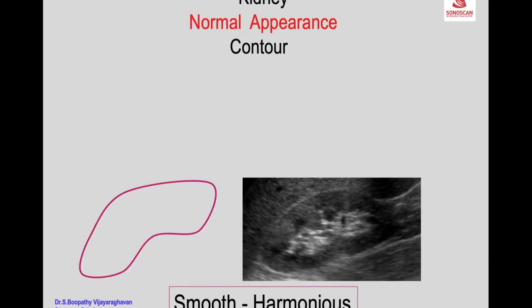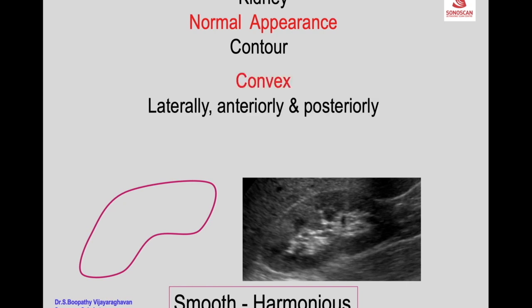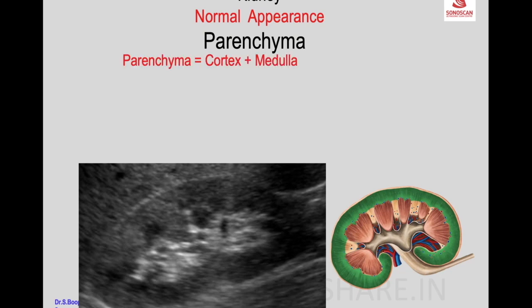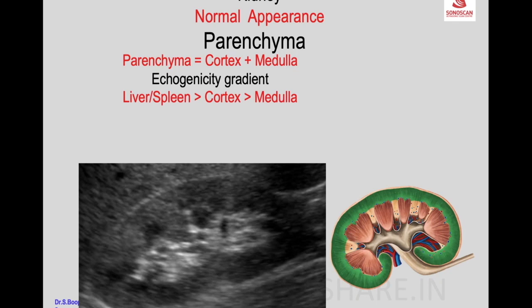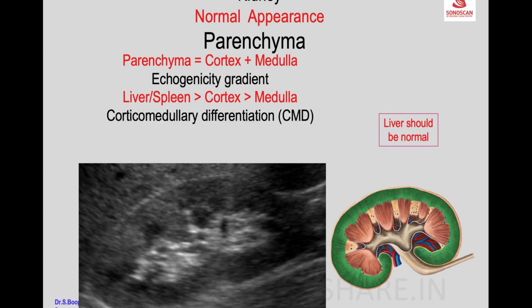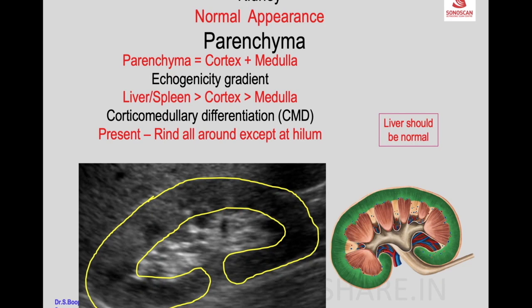The contour of the kidney is smooth and harmonious — convex laterally, anteriorly, and posteriorly, and concave medially at the hilum. The parenchyma contains both cortex and medulla; the medulla is seen as triangular echo-poor pyramids, more medial than the cortex. The cortex is less echogenic than the adjacent liver or spleen, and more echogenic compared to the medullary pyramids. This difference is called corticomedullary differentiation, which must be assessed to rule out pathology. The parenchymal rind is seen all around except at the hilum.